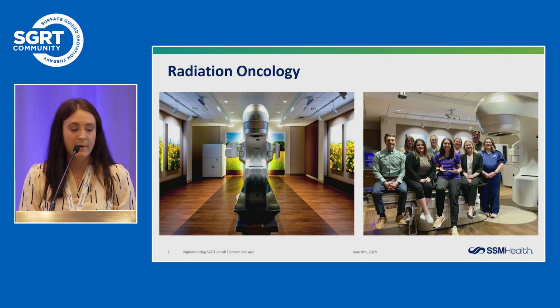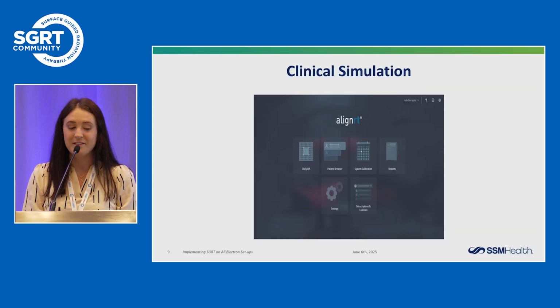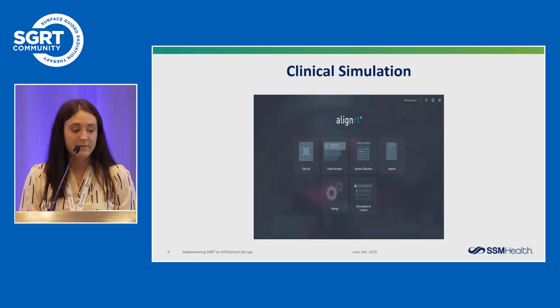So let's start talking about clinical electron setups. So I'll have to apologize if you're familiar with using this. I'm going to take you through click by click on how to do this, so bear with me if you're familiar with it. So if you're familiar with the system, you know that this is the main screen.